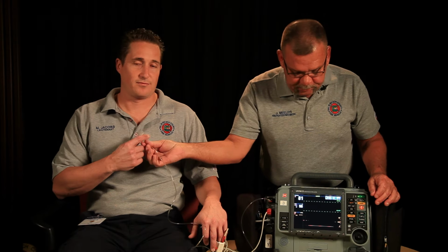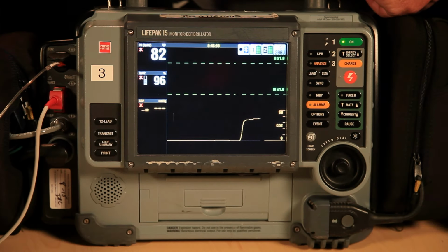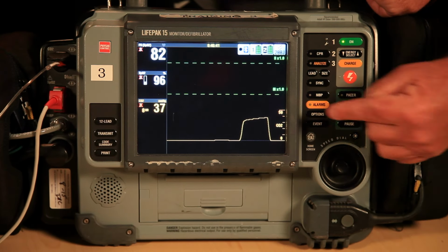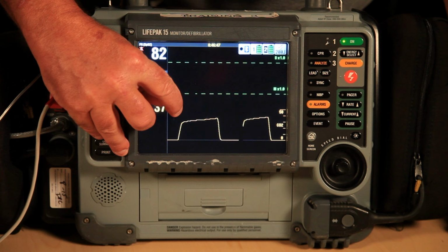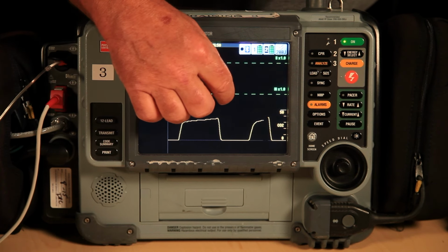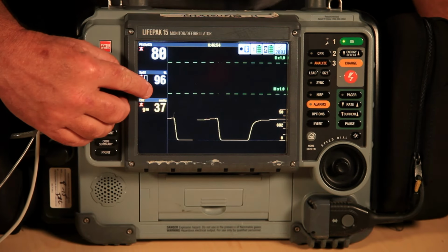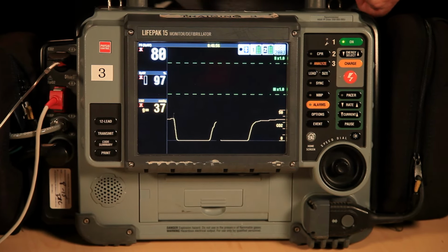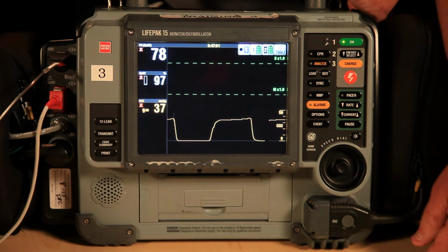We would then take this 15 to 22 millimeter adapter and hook it to our endotracheal tube. And once the patient begins to start breathing, and as we ventilate the patient, we would begin to see our capnographic waveform. This is the expiratory upslope. This is the alveolar plateau. Your capnometry number comes from this point, and that's your inspiratory downstroke. Currently, Lieutenant Jacobs' capnography is 37 millimeters of mercury, and he's breathing at 9 times a minute.